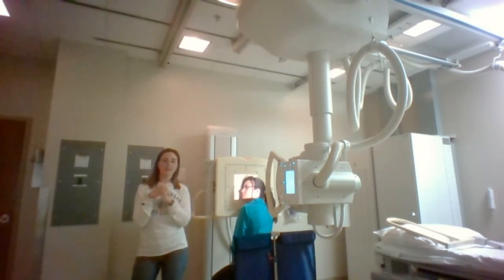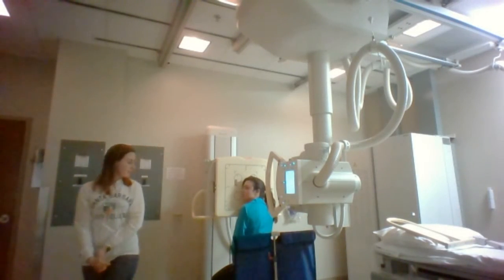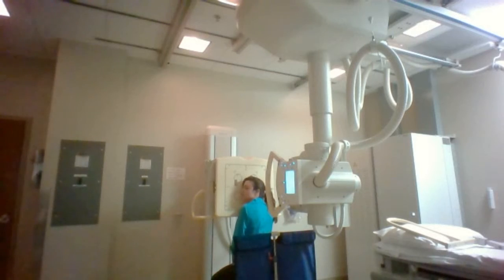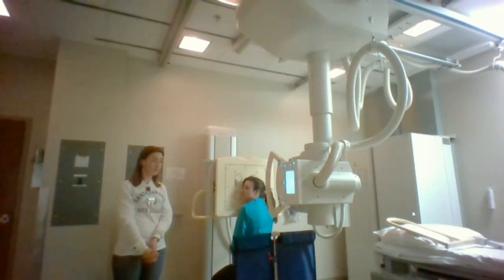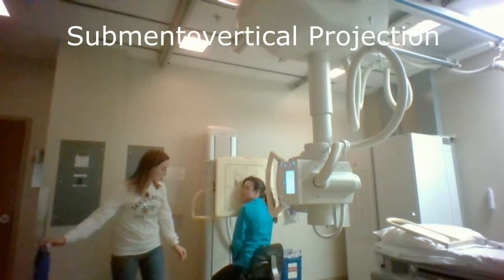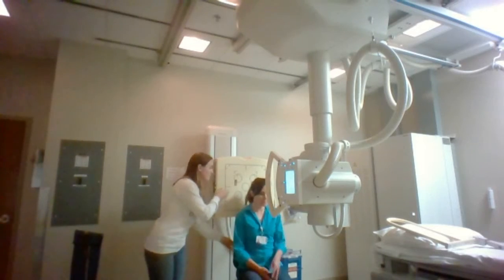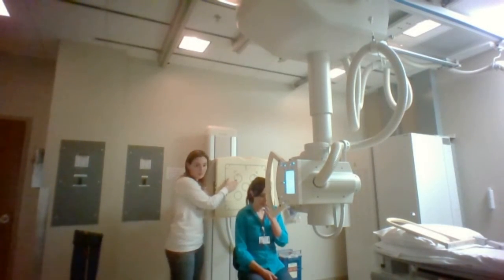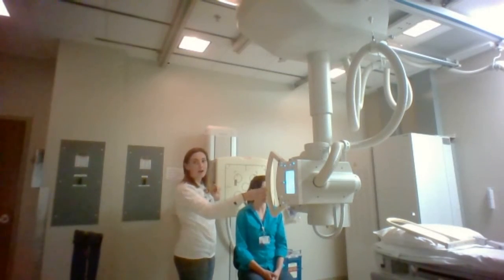I'm going to use a technique of about 85 at 4 mAs. So Sky, I want you to hold still and hold your breath. Expose. All right, so for this next one, we're going to be doing the submentovertex projection. Go ahead and turn around for me, Sky. There we go. So now I can keep using this marker because I'm still going to be marking her right side.